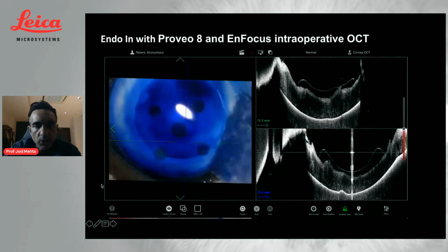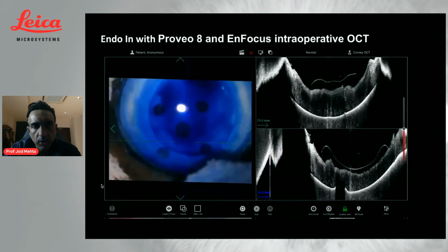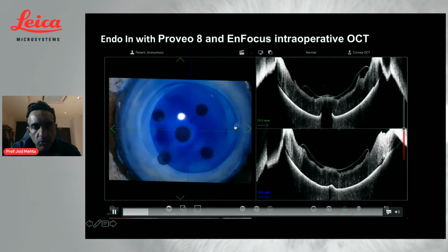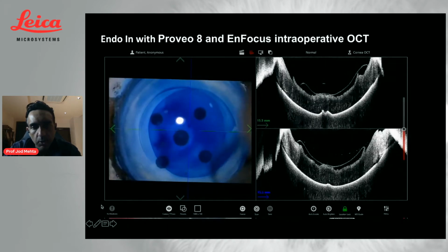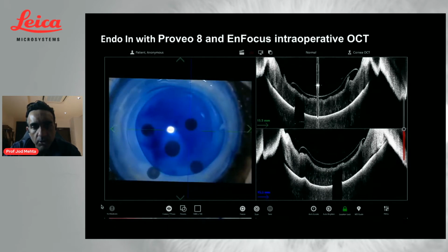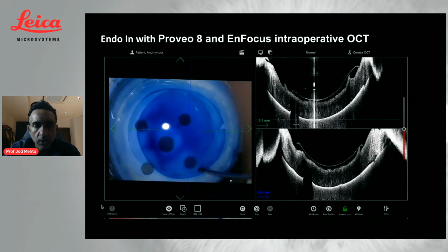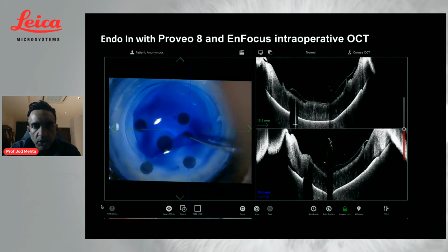Okay, so once we've got the graft stained, you're then going to go into a fold. Now you can see that I put a little marker over here, which is what we call an asymmetric triangle on the right hand side. This ensures that I will be able to tell my graft orientation because there's an oblique side and a straight side. The oblique side is on the right hand side, so when it goes into the eye, it's going to flip to the left hand side, so it tells me the orientation is correct.